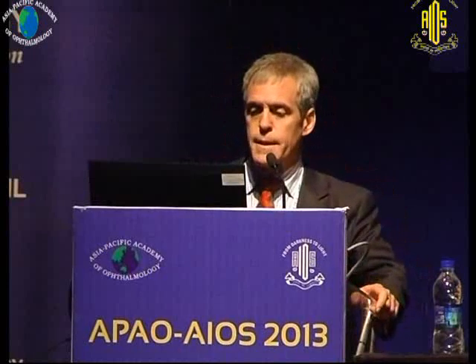During surgery, things can happen. We try to prevent such things as epithelial edema, fluid pooling, and we try to deal with the claustrophobic patient, etc. So if we've identified an at-risk eye, we may want to stop pilocarpine if they're on it and start Diamox instead. We might want intracameral phenylephrine at the ready if they're on Flomax. We may want to use a peribulbar or local anaesthetic rather than topical in a difficult case. We may have pupil hooks, Malyugin rings, VisionBlue, PMMA zonular support rings at the ready, and it'd be nice to be operating in a stable environment with a stress-free team.